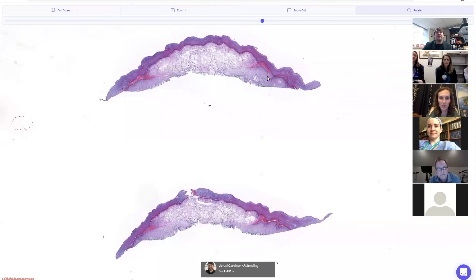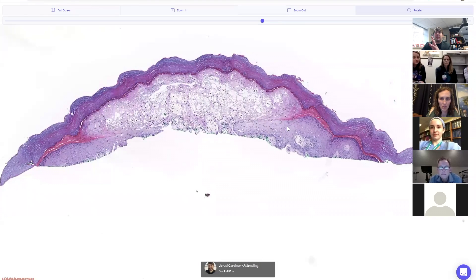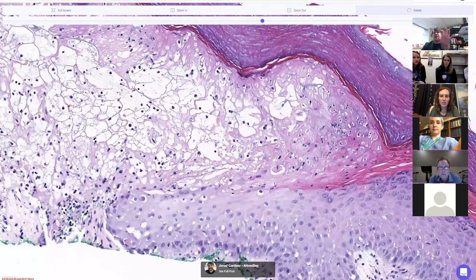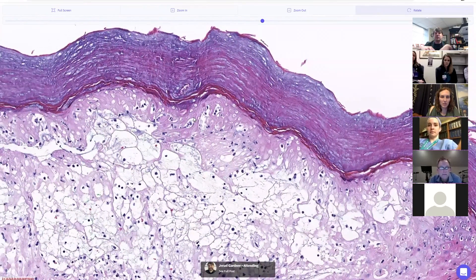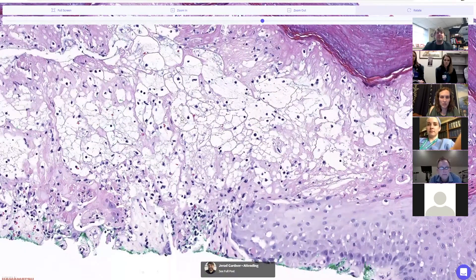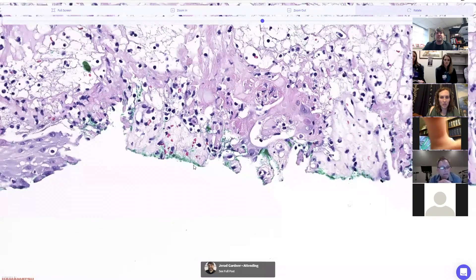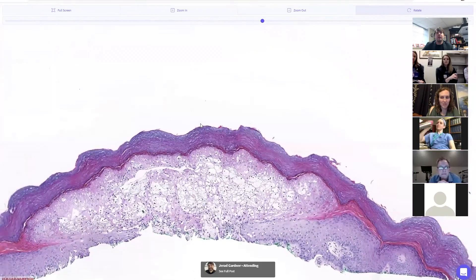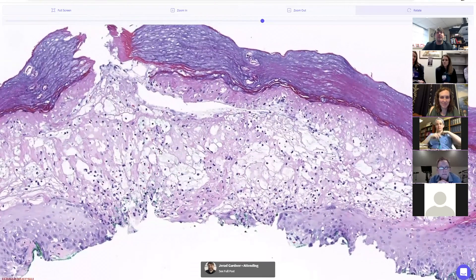Here's one other example — a smaller shave biopsy showing acral skin. It's a very abrupt lesion that goes from normal skin to a swollen area with ballooning degeneration. The corneal layer is still intact and the epidermis looks like it's died, swollen, and been pushed up by edema fluid. Underneath there's hemorrhage and edema again. This was also an example of hand, foot, and mouth coxsackie virus.